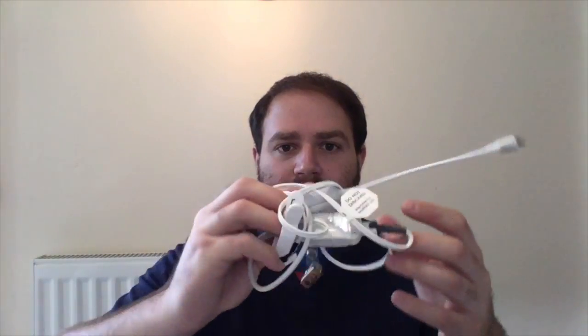Having SET, the perfusion index, and SignalIQ technology together in such a small device is great. We usually have those technologies in bigger, more expensive devices such as the RAD5 or the RAD7. Having all three technologies in a device that's basically as big as a cable — it's just a cable — is fantastic.